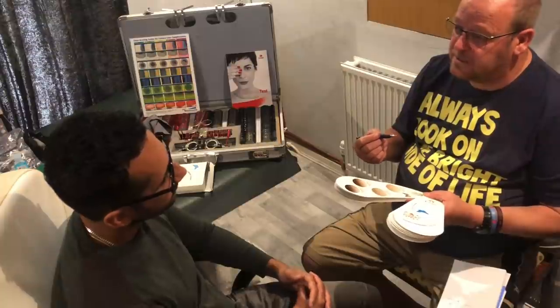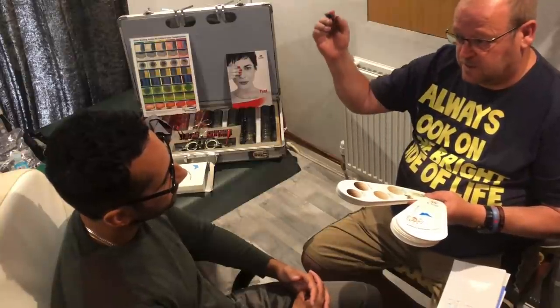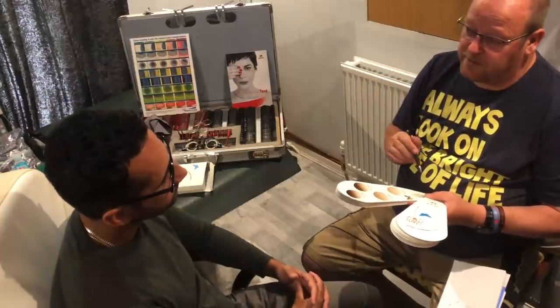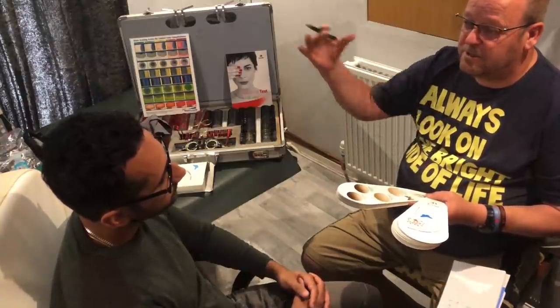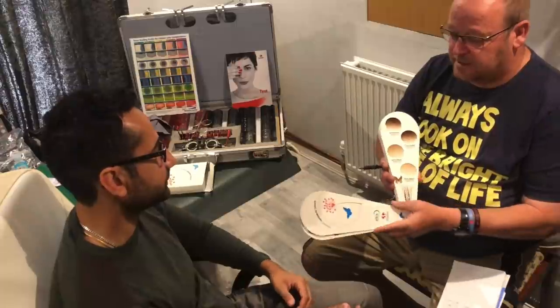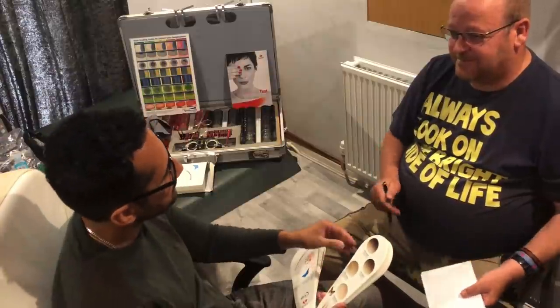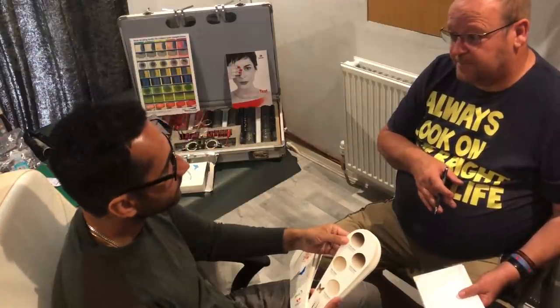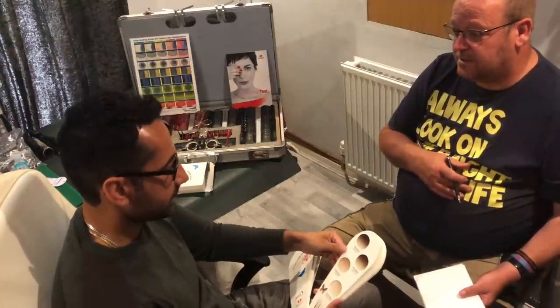If you've got a really poor photophobia, you could go for a dark lens which will stop the sun coming in. But the real problem is that when you go indoors, you then can't read because all the light's taken away. With the graduated tint, you still get the protection from the sunlight but you can then still read. That's a great idea. The advantage of having them — if you're wearing a bifocal or a varifocal, you have got your reading lens, but if you've got a dark lens, you're going to struggle to read.